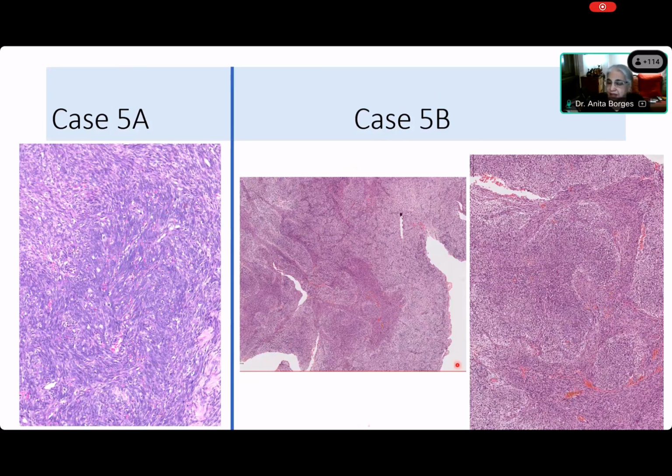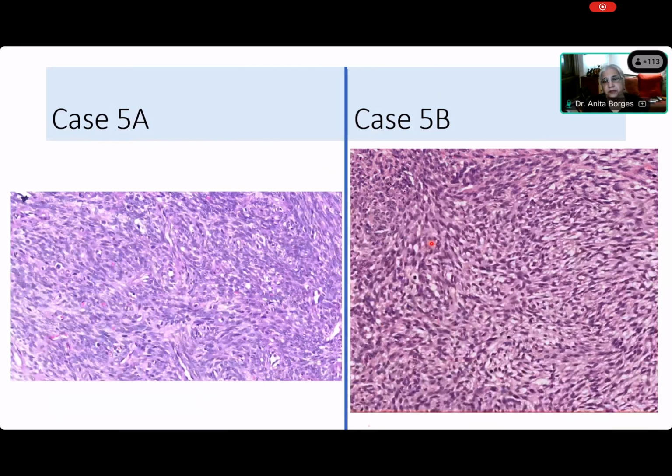You can see the way that these are fascicles cut in different directions because they are placed in that crisscross fashion. Okay, now go on. What do you notice about these two cases? 5A, the cells are spindly with moderate eosinophilic cytoplasm. All right. And 5B, there are more eosinophilic, it's just a matter of staining, right? So both of them are spindly. But you notice anything else?